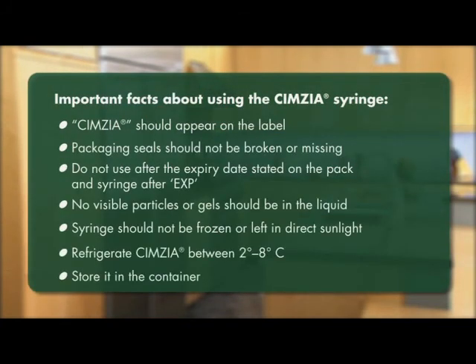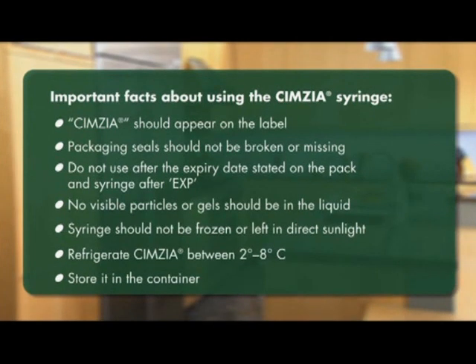First, make sure the name Symsia appears on the dose tray and the syringe label, and that the packaging and seals aren't broken or missing. Look at the expiry date on the syringe and pack. Do not use Symsia after the expiry date, which is stated on the pack and syringe after EXP. The expiry date refers to the last day of the month as shown. Make sure the liquid inside the syringe is at the fill line, and check that the liquid in the syringe isn't cloudy or discolored.